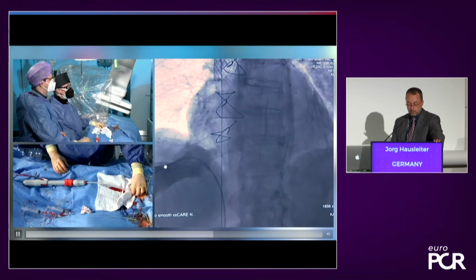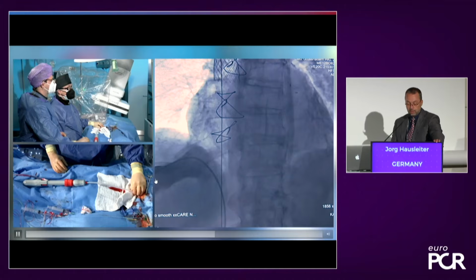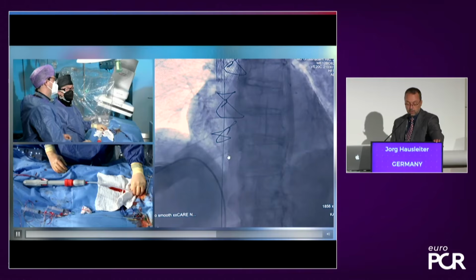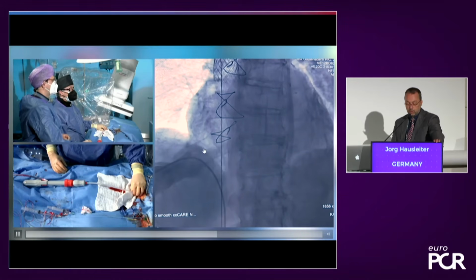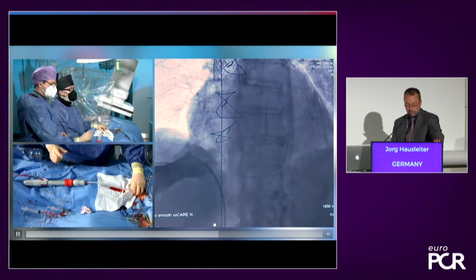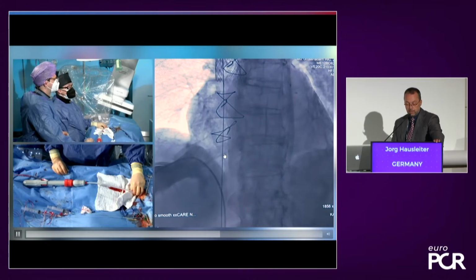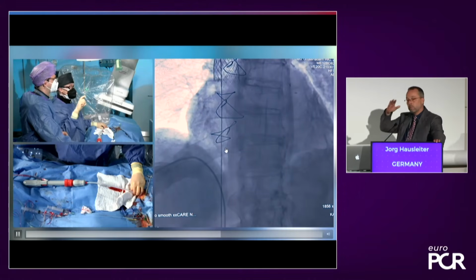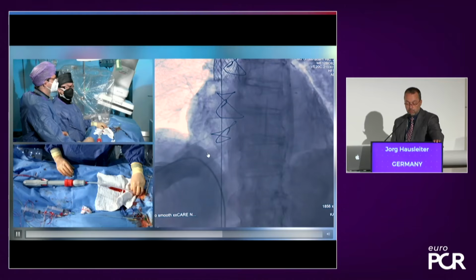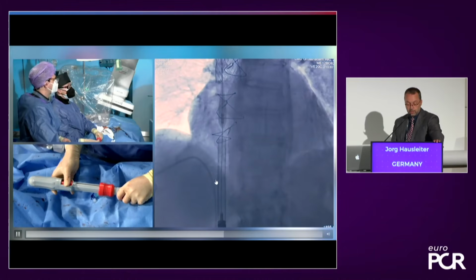During the placement, I'm just replaying the angio of the flow of the blood from the hepatic vein, so that we can appreciate, probably here, the transition from the hepatic vein into the right atrium. We're discussing the height, what is probably the best. Well, usually there's a little bit of oblique transition from the diaphragm, so we need to be sure that we are high enough on one side, but also not too high for the other side.